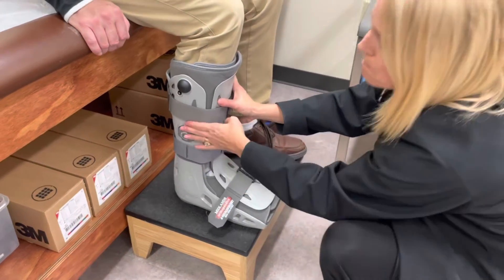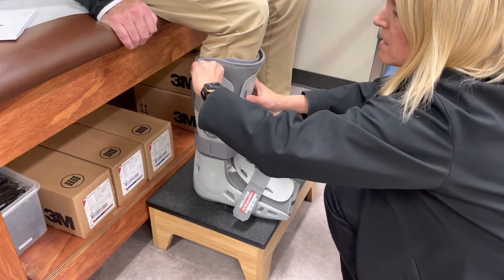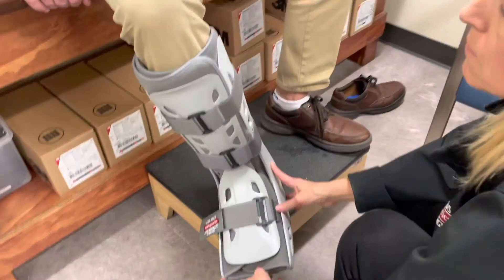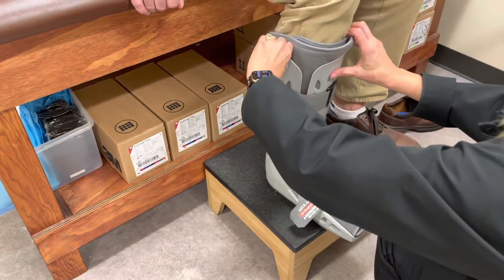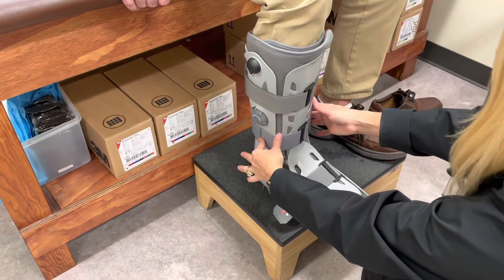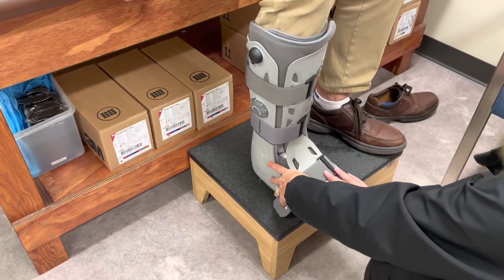There's a pump chamber. For chamber one, make sure the valve is open and typically inflate it about three or four pumps. Chamber two is on the opposite side — turn the dial to chamber two and pump it up the same amount. The patient will feel some air cells on the side, which just cushion the sides. Then leave it on the lock position — it's not something they have to mess with every time they take the boot on and off.